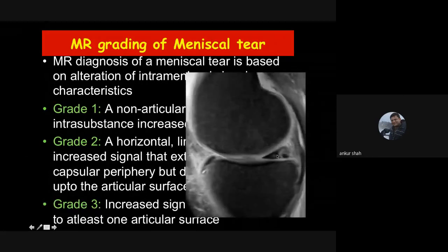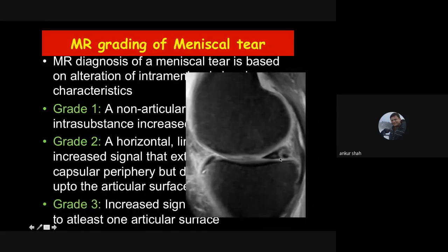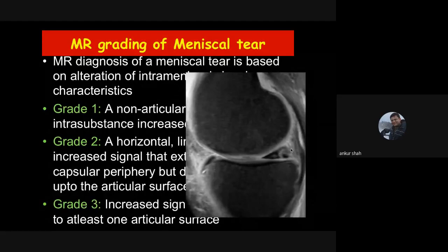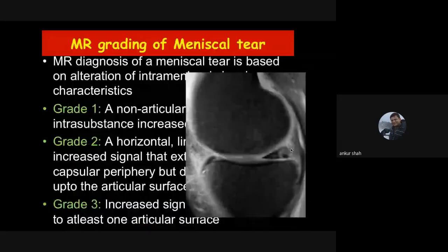We term it a tear only when it is grade three — when the hyperintensity reaches up to any one of the articular margins or the free edge, because then it will be seen on arthroscopy. This hyperintensity reaching up to the tibial articular margin is the appearance of a grade three meniscal tear. An exception: if grade two signal is associated with a parameniscal cyst, it can be termed a grade two tear. Otherwise, grade three is when we call it a meniscal tear.